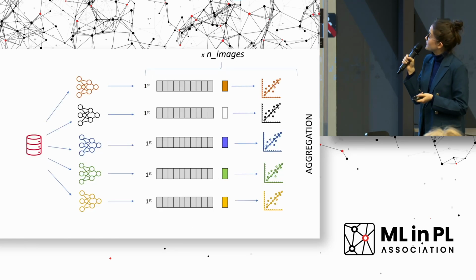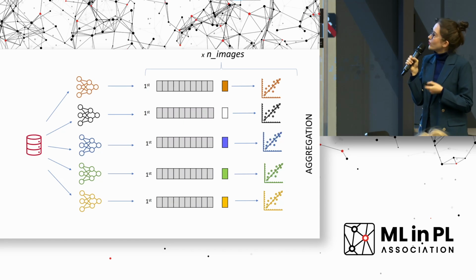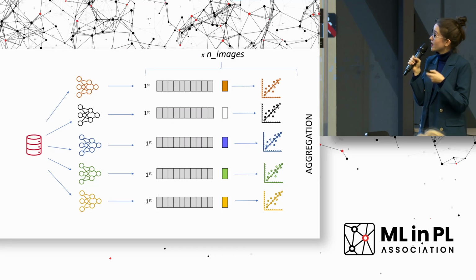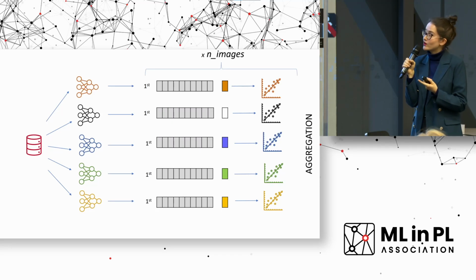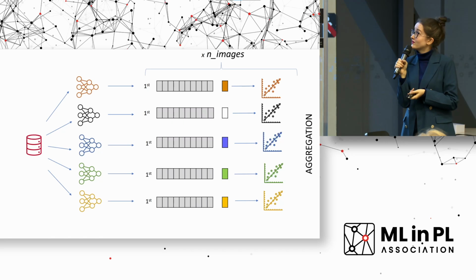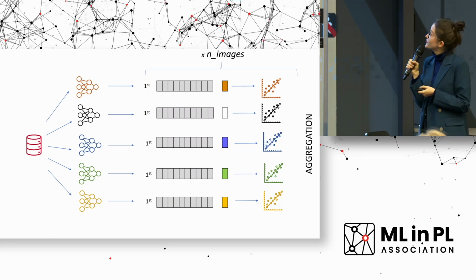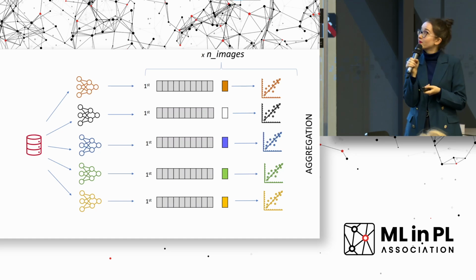Okay, so just to sum up what we do. We have a fixed test set, and we have 5 trained models. Why 5? Because we use cross-validation during the training time. This is why we have 5 copies of the models. Then we get the features for each patch and the corresponding attention scores.